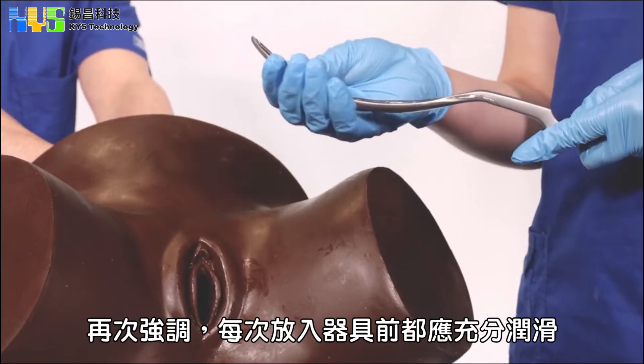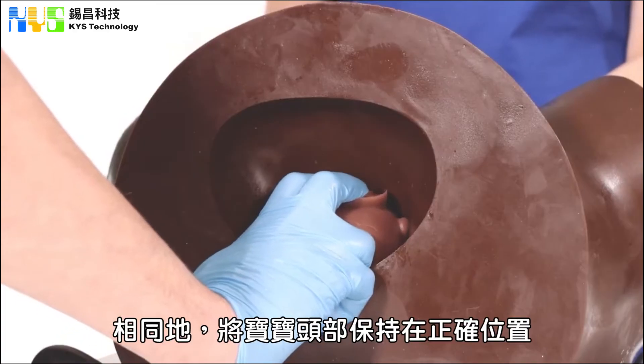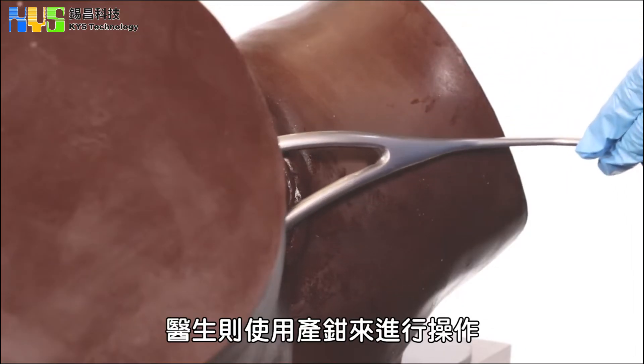Again, please ensure the forceps are well lubricated between every use. The mother will again hold onto the head in the correct position, whilst the obstetrician will follow the instrumental procedure using forceps.